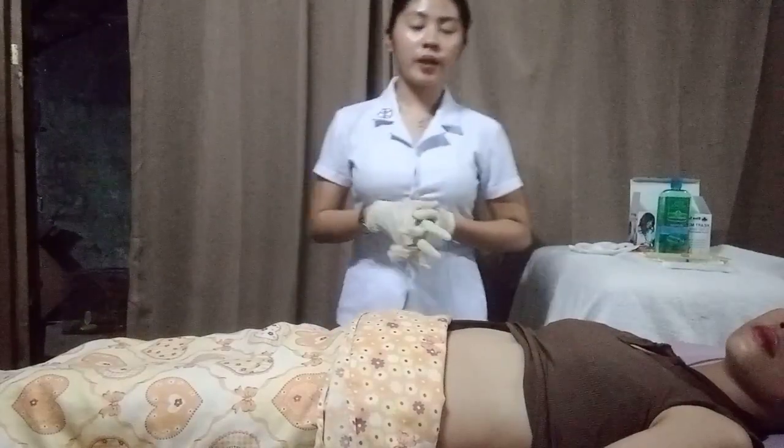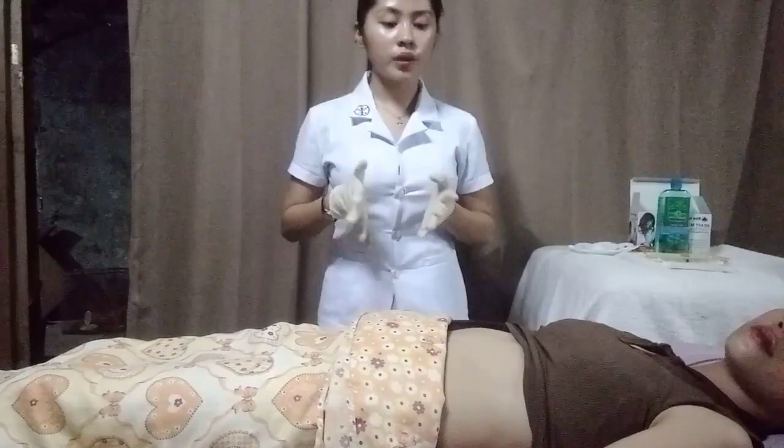And then now place the patient in a comfortable position and document. The last procedure is the intramuscular injection. Intramuscular injection is the introduction of medication deep into the muscle tissue where a large network of blood vessels can absorb it readily and quickly.